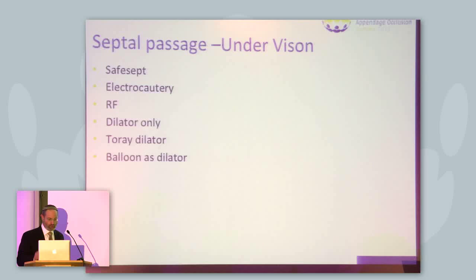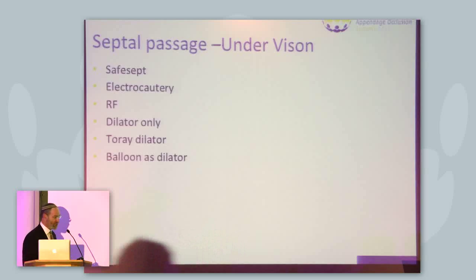If you perform your septal puncture under vision, then you will be able to determine up front whether there's going to be problems, whether by pushing your needle you don't go through, if you slip upwards, if you slip downwards, if by turning, whether it turns anteriorly as you advance it, whether the septum is so aneurysmatic that you reach out to the free wall.